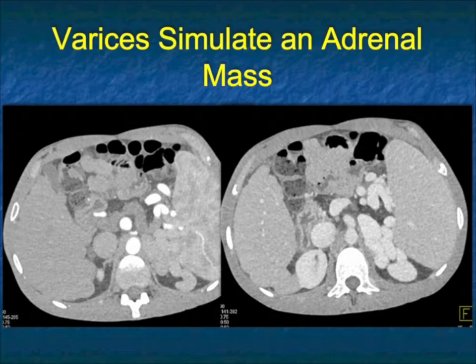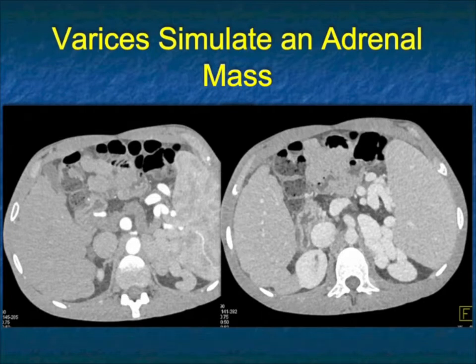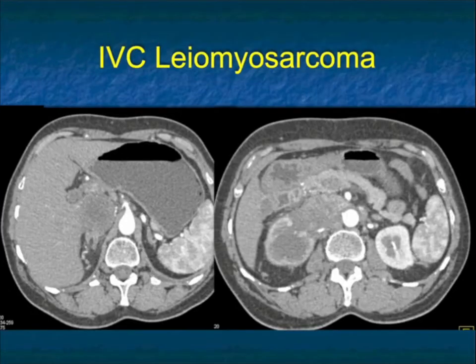Sometimes things can confuse you. On one image there's fullness by the left adrenal bed, but if you look carefully, the patient has cirrhosis and splenomegaly — what you were looking at were multiple large varices. I've occasionally seen large varices confused with an adrenal mass. I've also seen a diverticulum off the fundus of the stomach confused with an adrenal mass, though usually confused with an adrenal cyst or adenoma rather than a carcinoma.